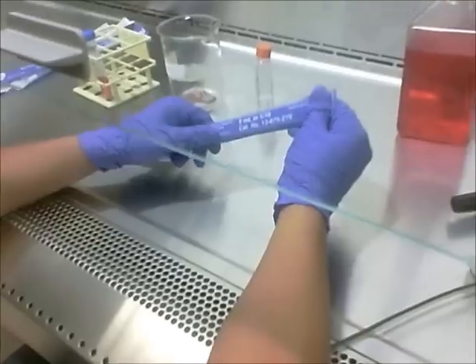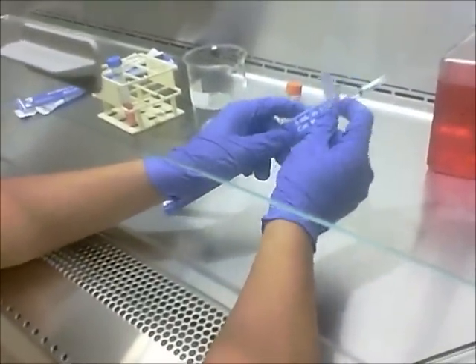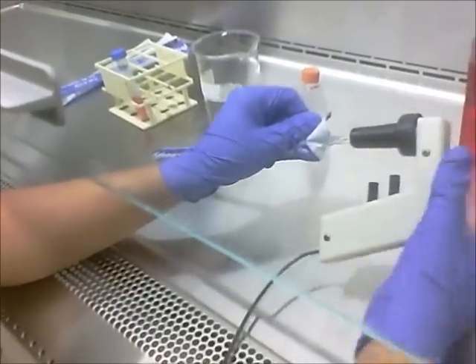We're going to view the pellet — as you can see at the very tip there is a white dot, that is our pellet of cells. We're going to remove the media and resuspend the pellet in new media into a new flask. Once again using a new pipette, we're going to remove the media from the centrifuge tube, making sure to leave our pellet.